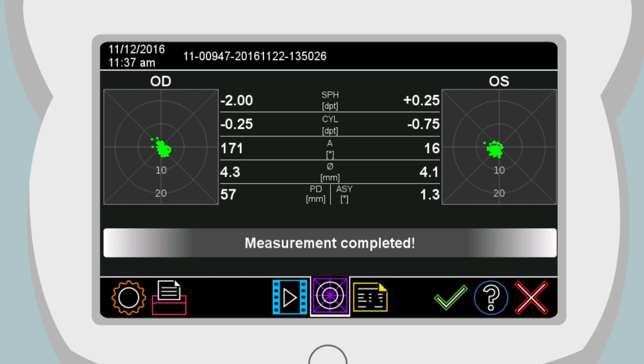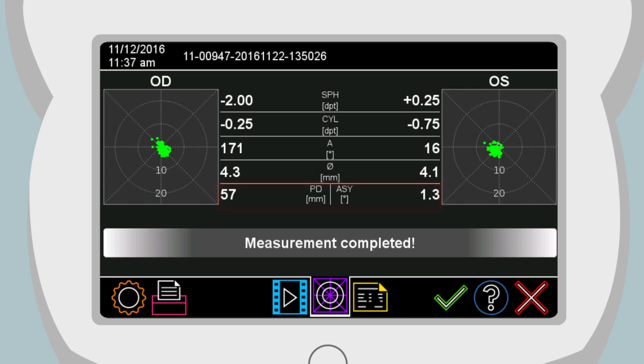Displayed in the measurement result is the Sphere, Cylinder, Axis, Pupil Diameter, Pupil Distance and Gaze Asymmetry. These measurement values are also reported on all printouts and in the patient database.